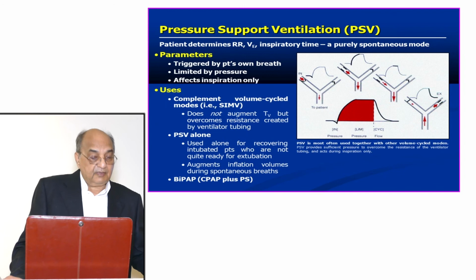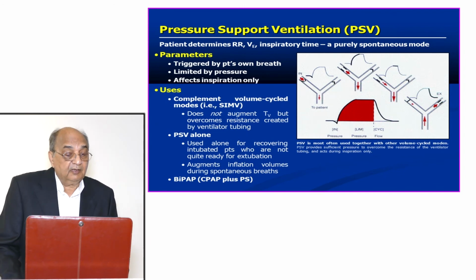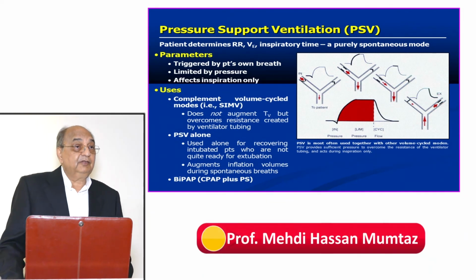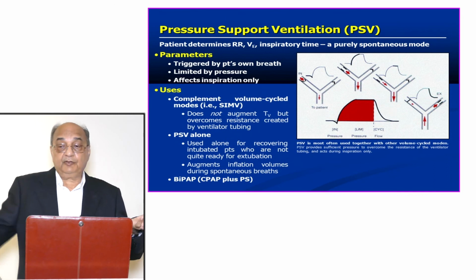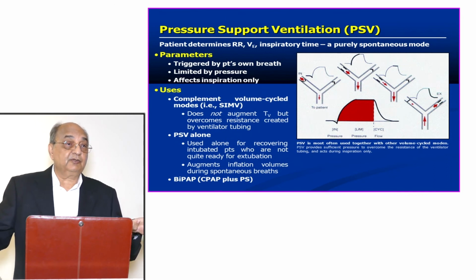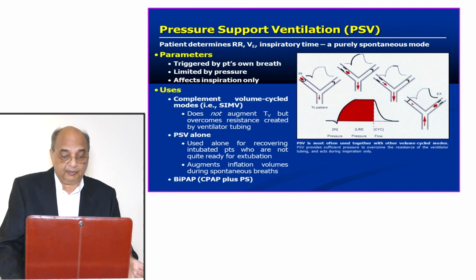Now, it's very useful when the patient is put on volume cycle mode and the patient starts breathing by themselves, and you put a little bit of pressure behind it so that it normalizes the tidal volume which is being delivered to the patient.